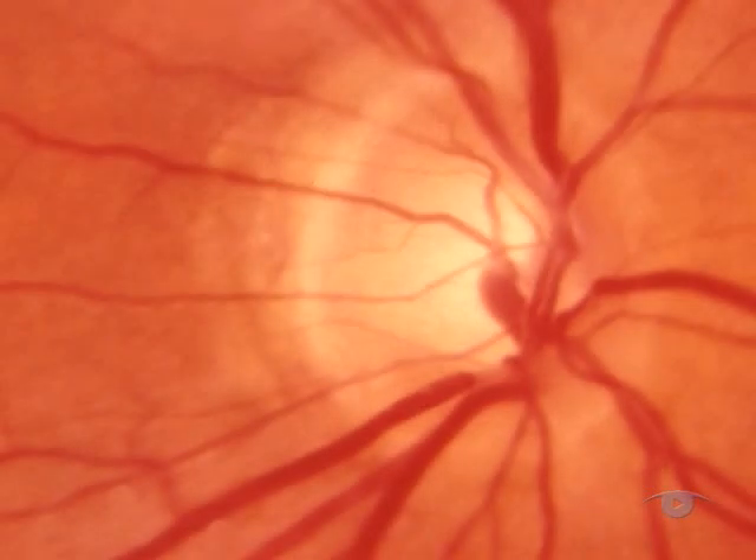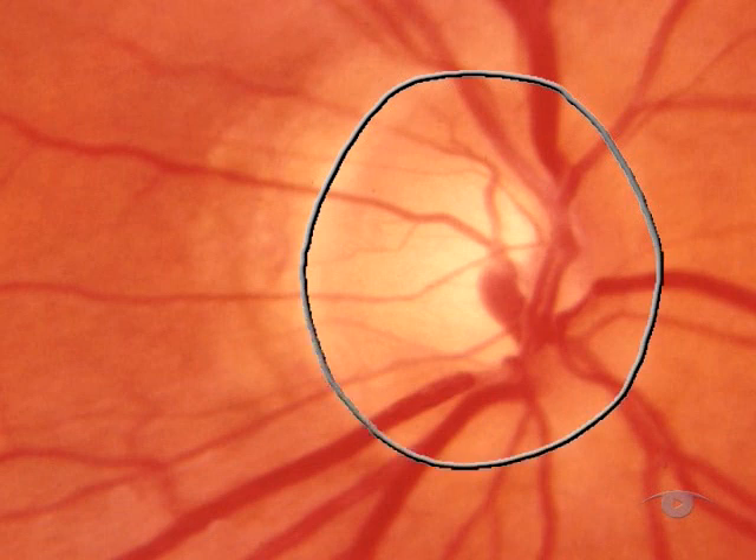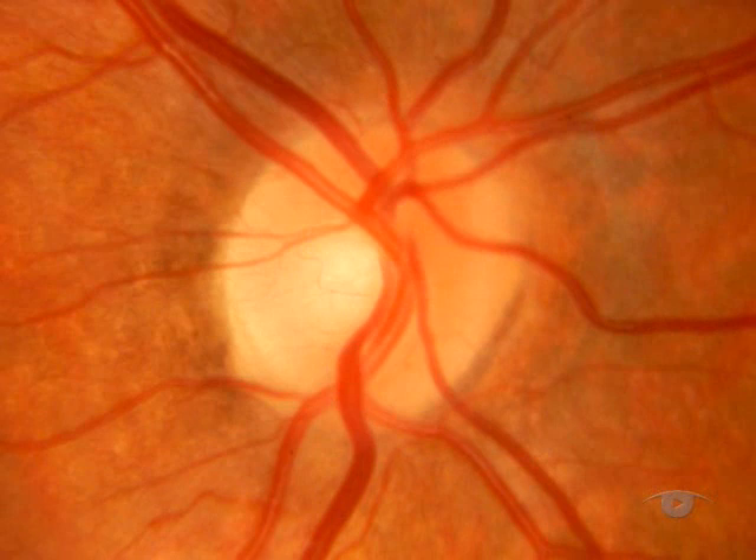Your primary aim is to identify the optic disc and keep it in focus using the lens wheel. Having found the disc, use it as your reference point — a sort of base camp for exploration of the rest of the fundus. Look in turn at its margin, its colour, and its central cup. A healthy optic nerve head is an orange-pink colour with a clear disc margin and has a central cup from which the vessels emerge.